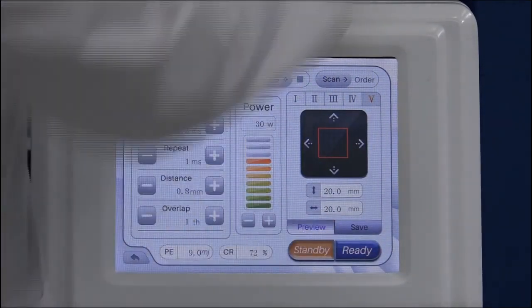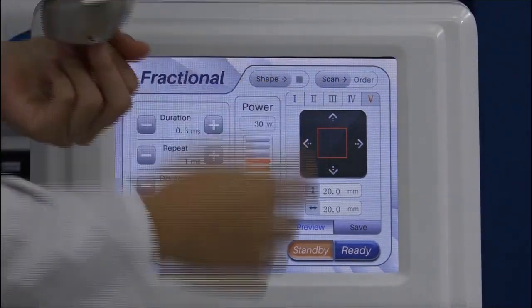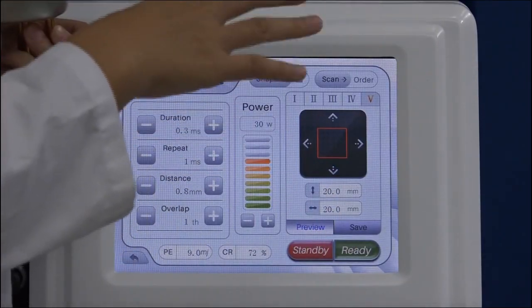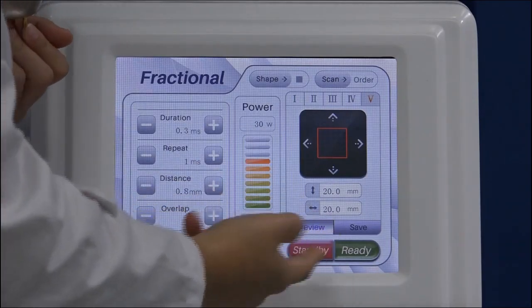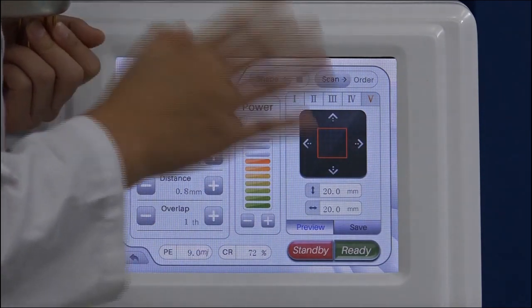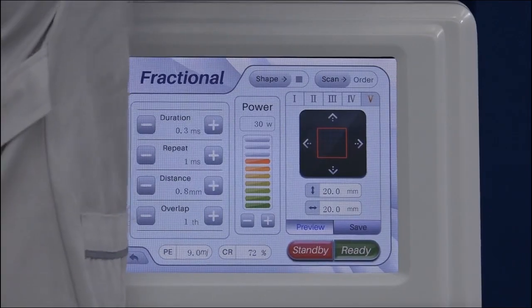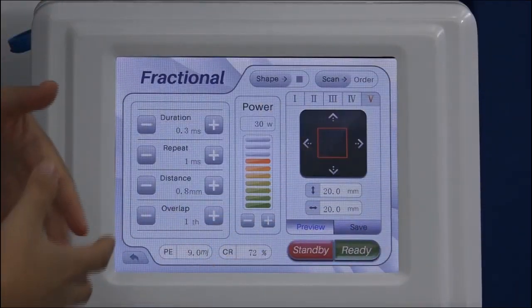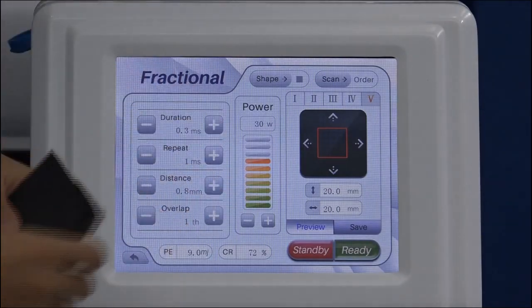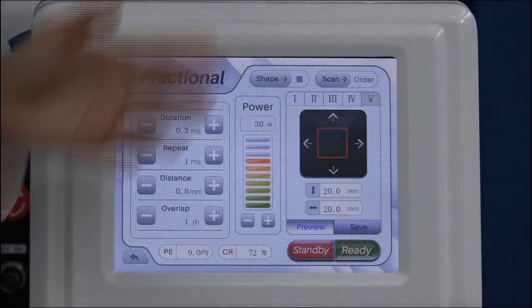And the preview, we have a leading guide of the preview. It can show where the laser is. So you can press the preview. We have the white line to guide you where the laser will be working on. Okay, this is the interface. It's very simple to use. And now we can introduce some suggested parameters for which treatments you can use.